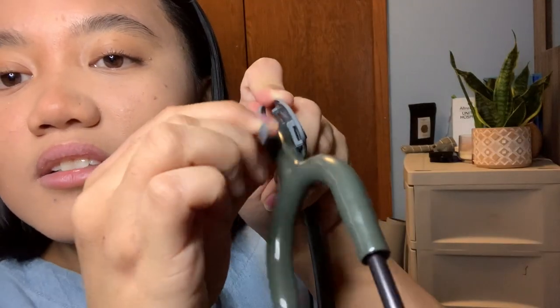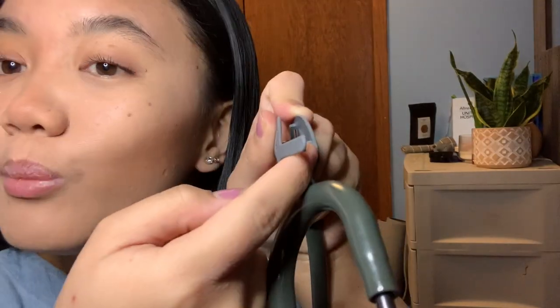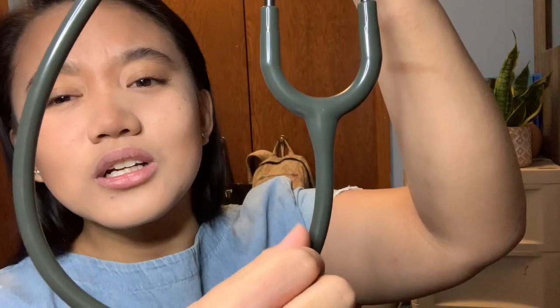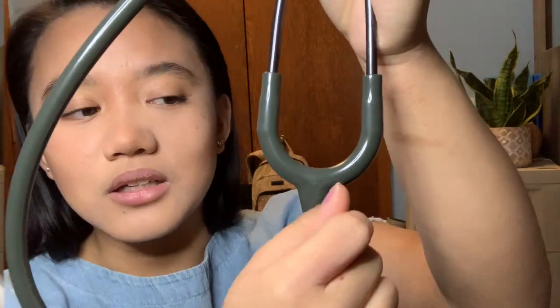Then you're going to take this and insert it right in there like a little belt, and you'll do it on the other side as well. You can also just wrap tape around it and write your name.